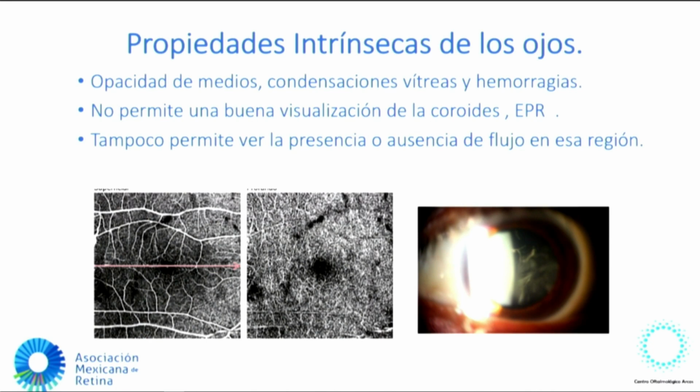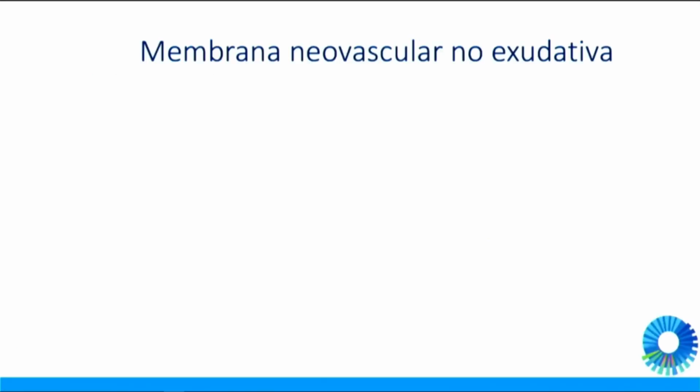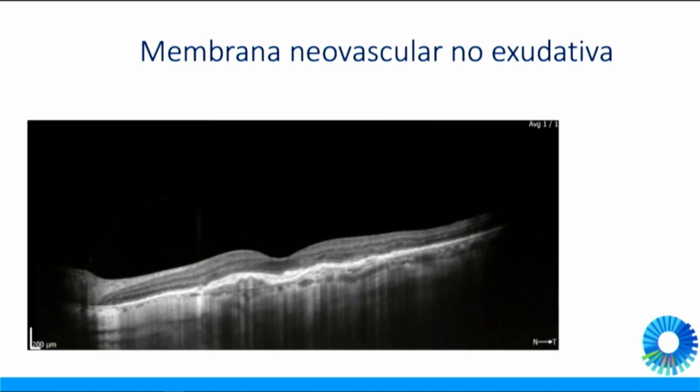Okay, he got called upon. We checked him. He got dilated, and he had a great condensation on the vitreous body. These can simulate these artifacts, and we might then run the risk of poor diagnosis. So we need to clinically correlate mode B, angio-OCT, and other multimodal approaches.